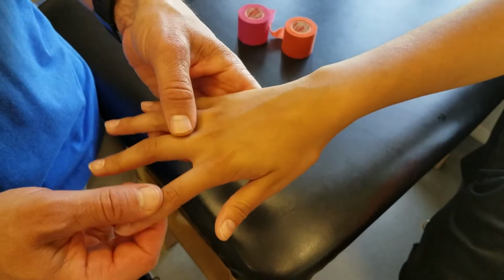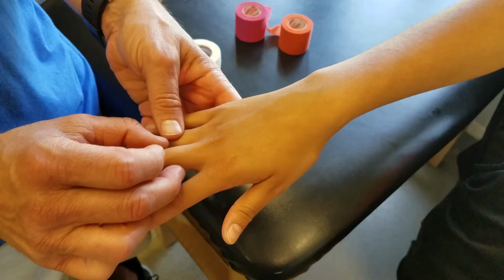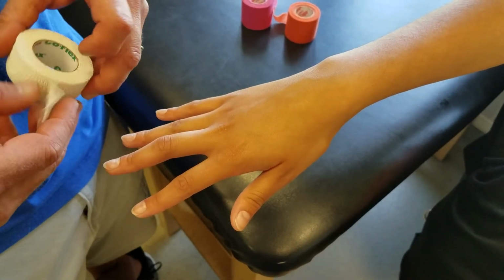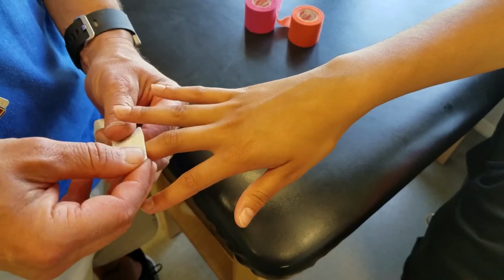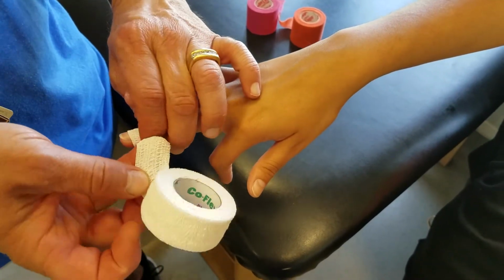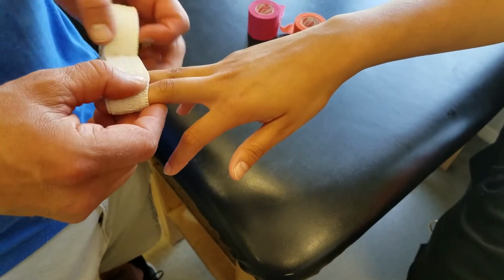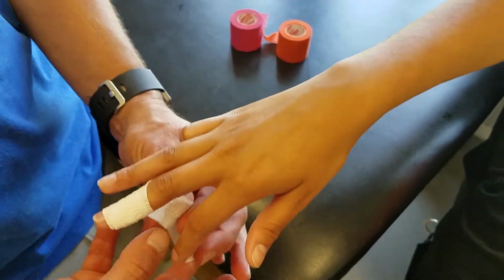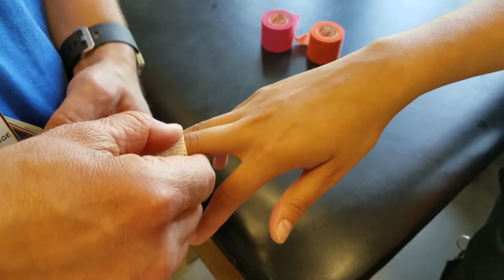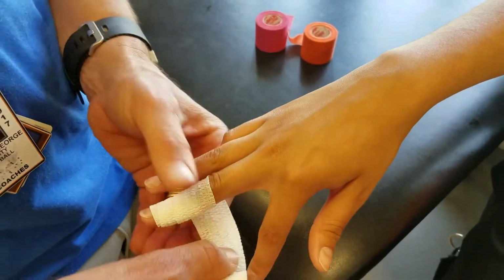What I like to do, when a kid comes in, "Oh, I jammed my finger," and you notice the PIP joint is starting to swell, is use this 1-inch Coflex and do a compression wrap here. I don't put it on super duper tight, but I just wind it up, going from distal to proximal. So I go from the tip of the finger all the way down to the metacarpophalangeal joint.